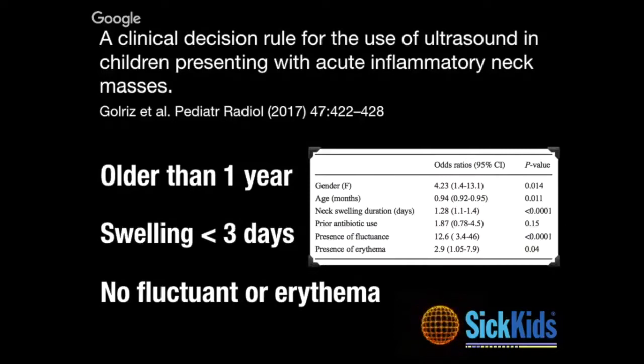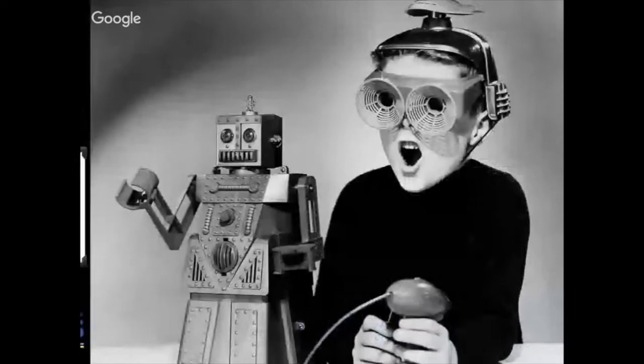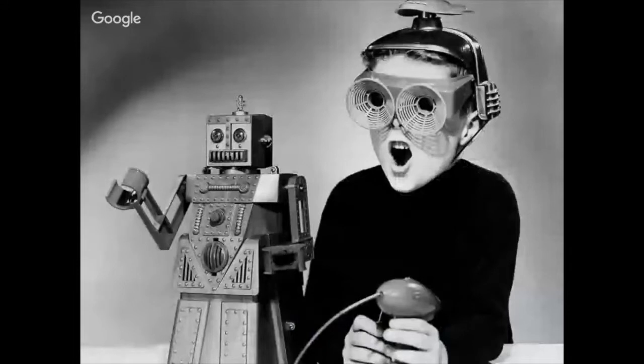I agree. For us at the bedside, with the ease that we can do point-of-care ultrasound, I think we should include it as part of our history and physical. But I think it is interesting to think about who's going to need drainage and what we're really looking for. So anyways, I think this is pretty cool. It's pretty simple when we think about this really short term, and it's the future to really do this well. And again, the key things: we're looking at shape, flow, and architecture as we look on that spectrum of infection from early to late in abscess.